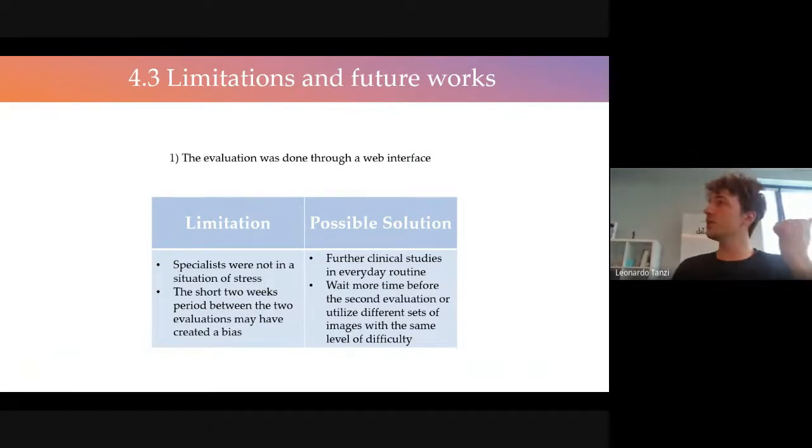The evaluation was done through a web interface. The first problem is that we wanted to demonstrate that this tool could be helpful in stressful situations, not in a situation when the specialist is sitting at the desk looking at the femur. So we should do more everyday testing, in the working environment. The other problem is that we waited just 2 weeks between the two evaluations.